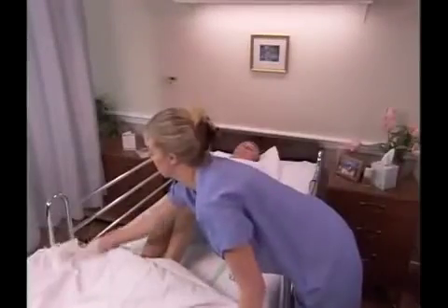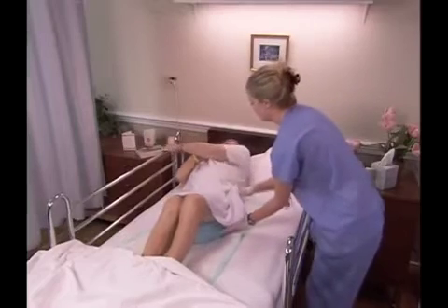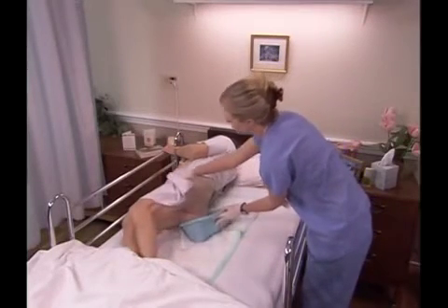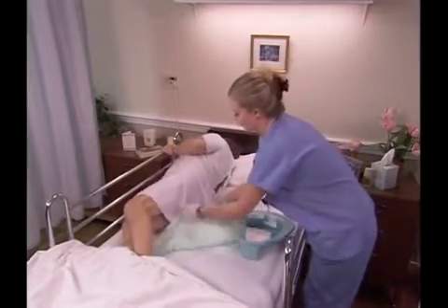Using the second method, help the person to roll onto her side, facing away from you, while you hold the bedpan securely in place against the mattress to prevent the contents from spilling. Remove the bedpan and the bed protector. Cover the bedpan with the bed protector.